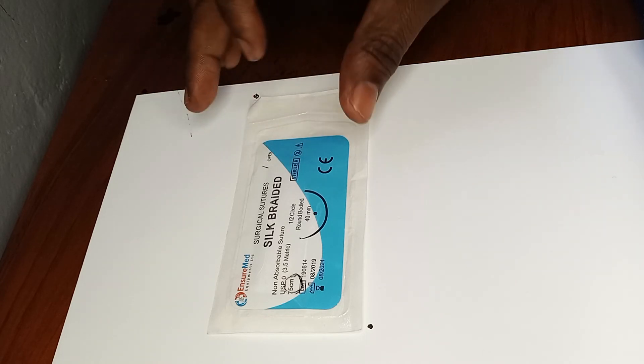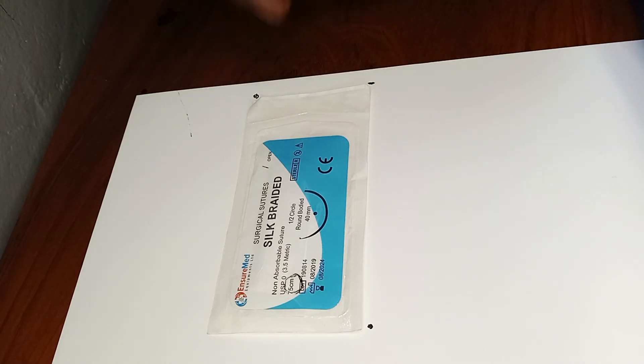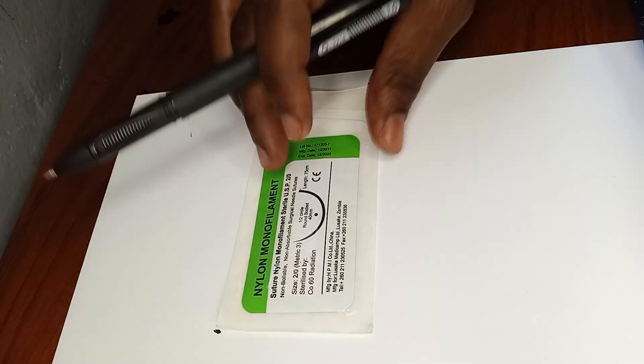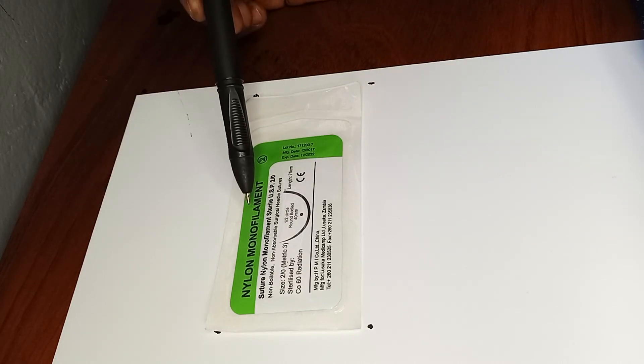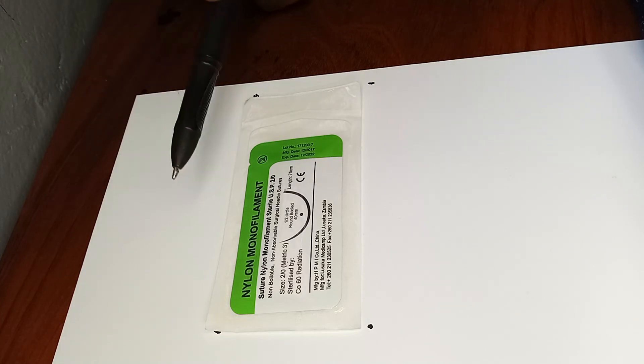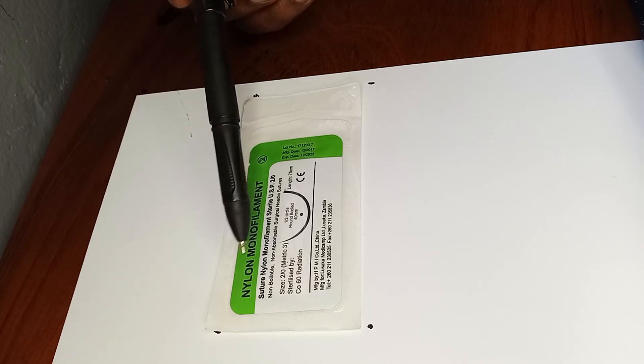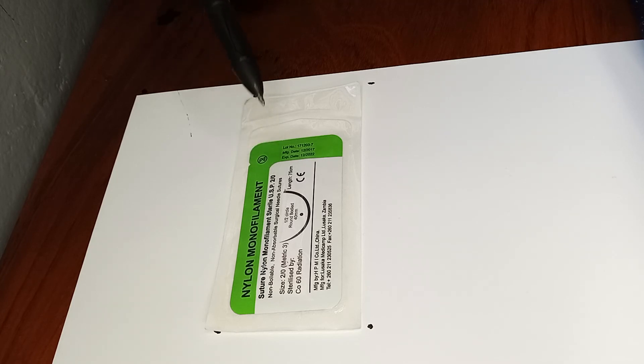All these sutures are sterile and should be opened in a sterile manner when given to the team — the inside must be kept sterile. The last common suture we'll discuss is nylon. Nylon is monofilament, meaning there's only one thread — not multi-filament — making it a good suture for places where you need it to stay long or be permanent. This nylon is a two zero — the same size as the catgut — and a three zero would be smaller than two zero, and a four zero smaller than three zero.